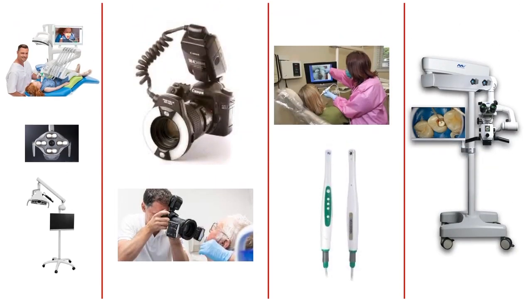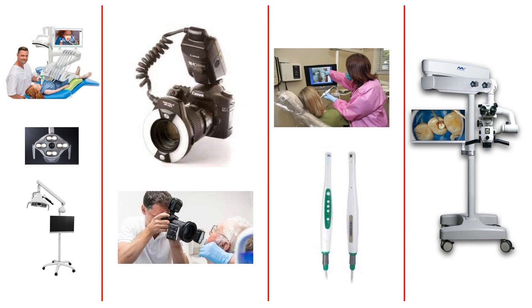So generally, the tools used for magnification are the following. First of all, today they have innovated a tool which is a camera inside the light, maybe a kind of floor mounted type.